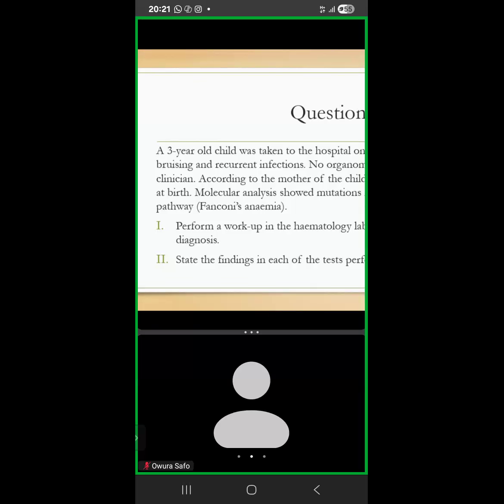And then we are looking at the bone marrow because that's how we do our workups. We have said that full blood counts and the peripheral blood smears that we make are what we call screening tests, and so you follow through to the next level of tests.